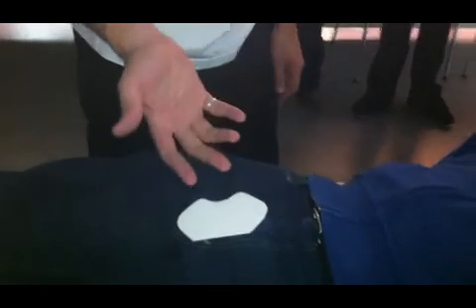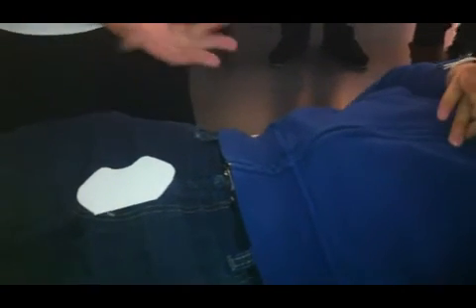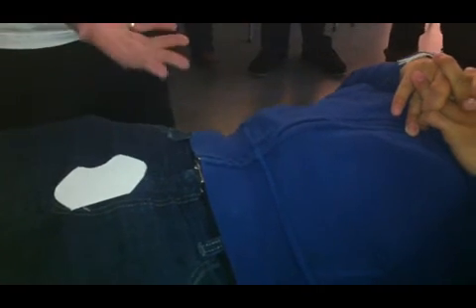Because if you don't find the symphysis, you are probably not going to use a shield. I can say it as much as I want, but the general fact is, if you're not comfortable doing that, you won't use a shield. You'll think, I don't want it to get in the way. I don't want to have a perfect pose and have to repeat it just because my shield's off a little bit.